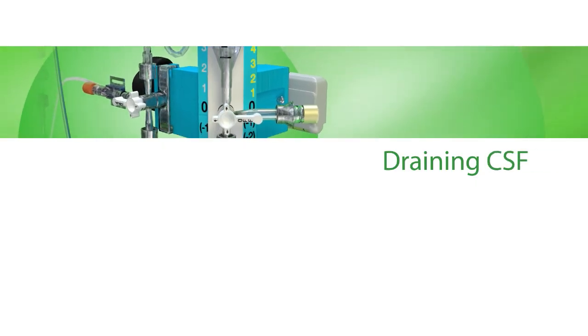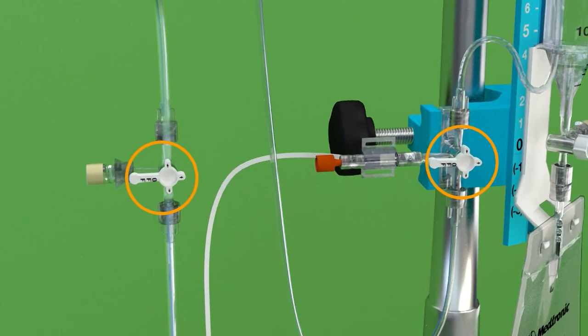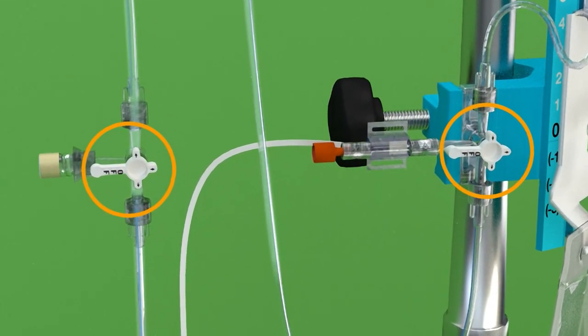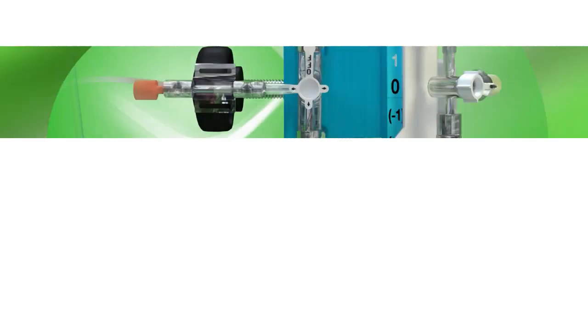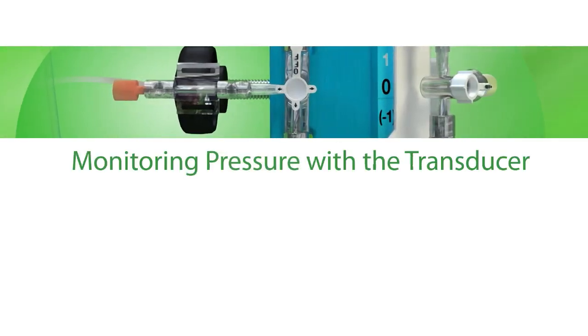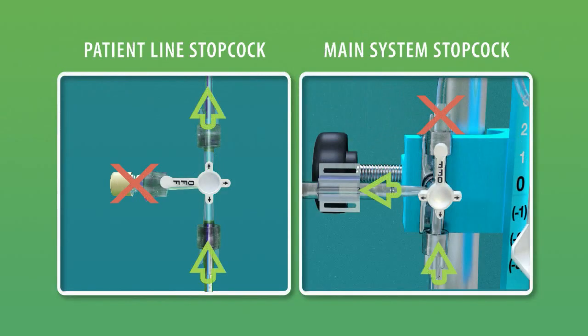Draining CSF. To drain CSF, position both the main system and the patient line stopcocks as shown. Monitoring Pressure with the Transducer. Position patient line and main line stopcocks so that the fluid flows to the transducer adapter as shown.